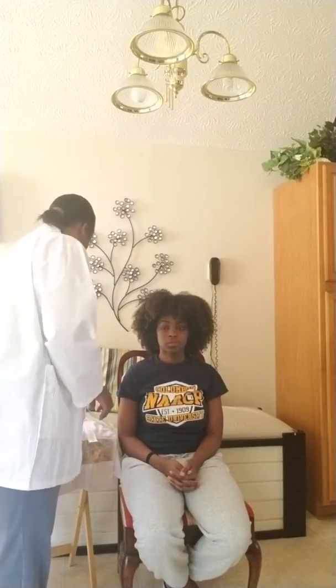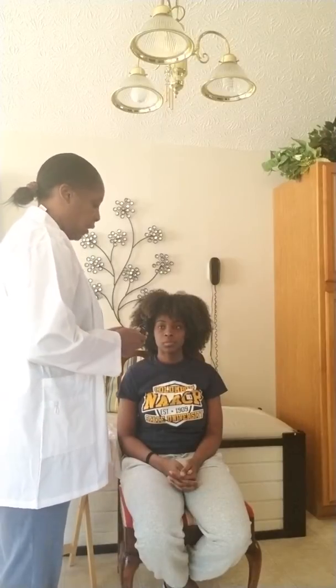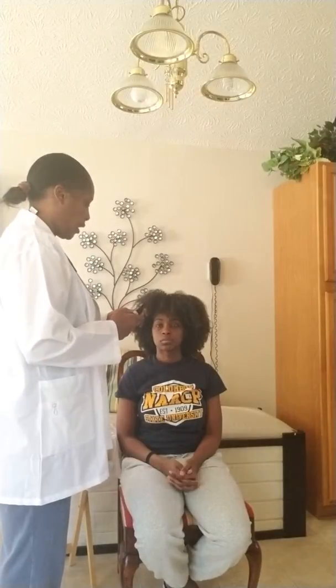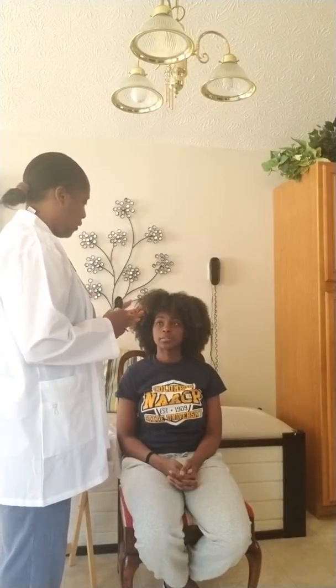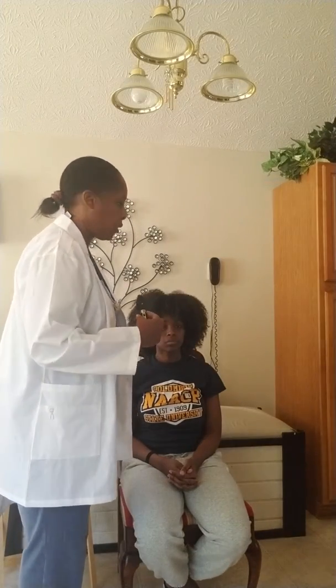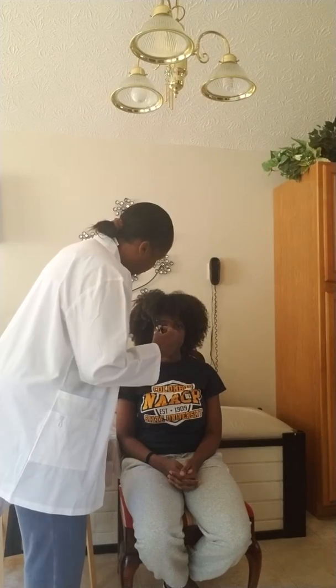Now I'm going to check the pupils using my ophthalmoscope. I'm going to shine a light into your eyes, okay? If you look straight ahead. Right now I'm just going to be observing the lens. I'm going to be looking at the sclera, and I'm also going to be looking at the cornea. I'm not really going to look at the pupils just yet. I'm just going to do this obliquely.